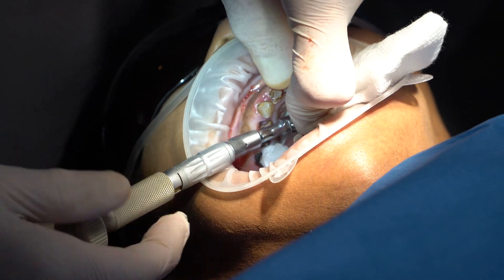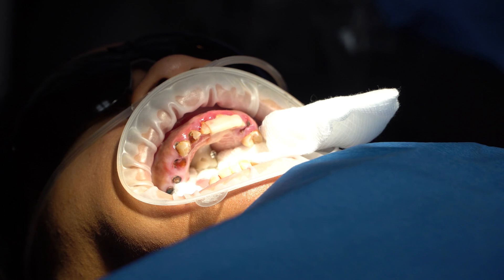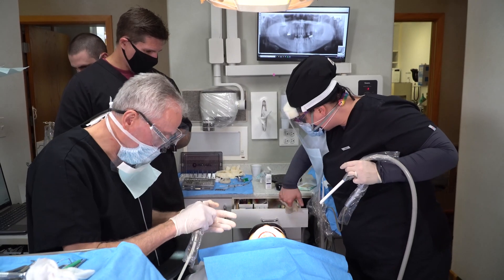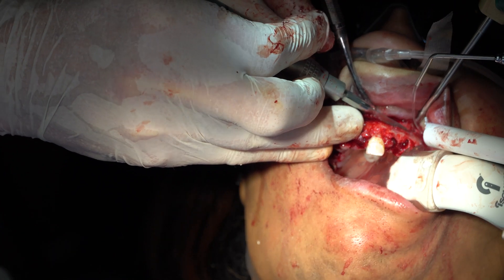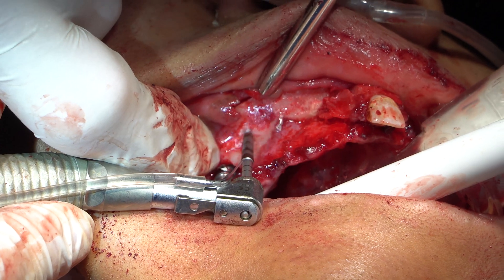We placed an artificial reference tooth that we're utilizing to align the data after we placed the implants. Then we were able to extract all of the teeth. We kept one tooth as a reference and now we're going to place the implants.